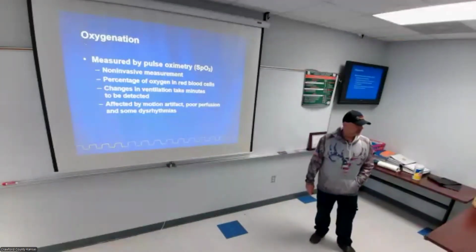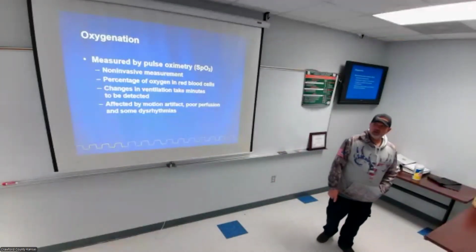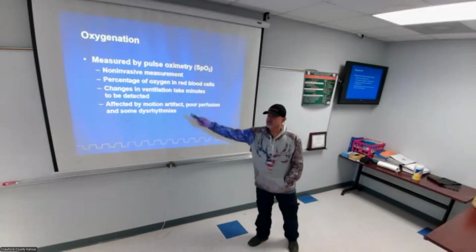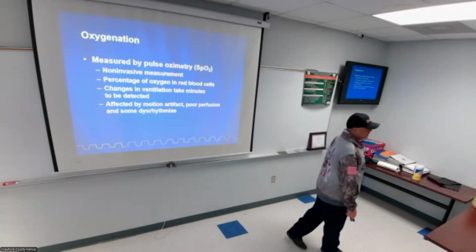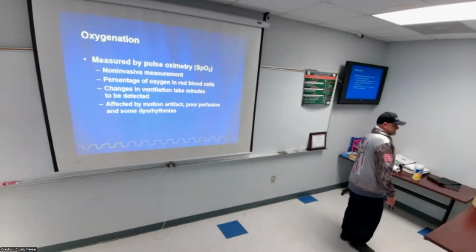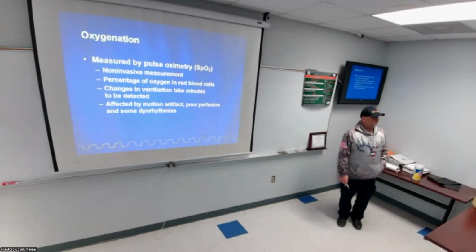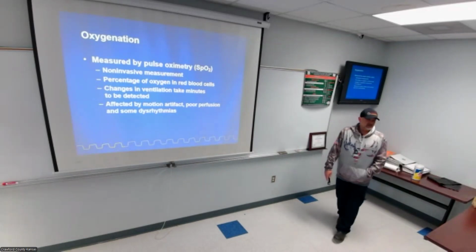Those will give you poor O2 saturations. What I do not like about this is it takes minutes to detect if it changes. So if you got your patient oxygenated, your patient can stop breathing for 5 minutes before that thing even starts to measure down. Your patient may not even take a breath.